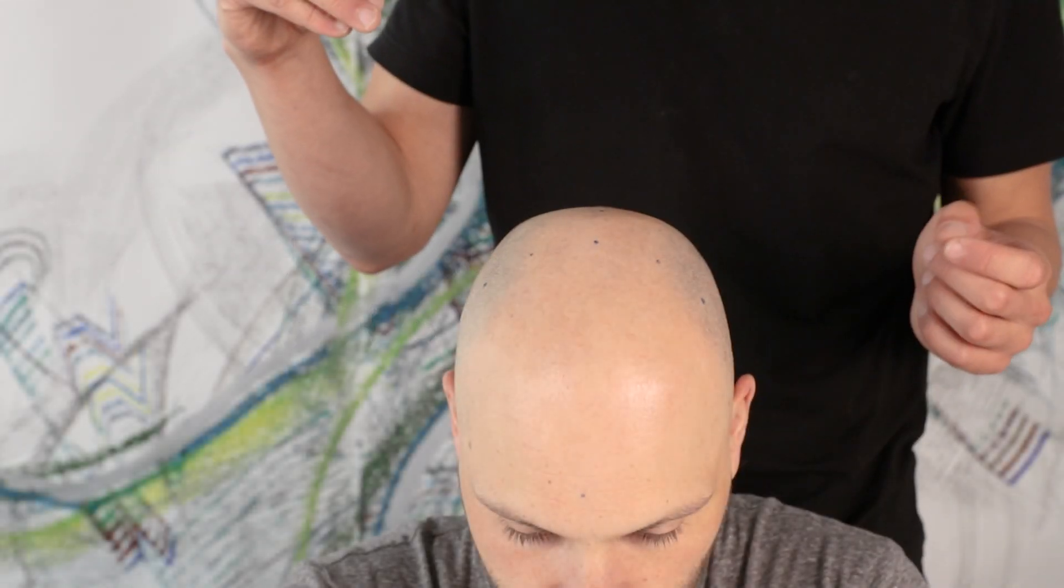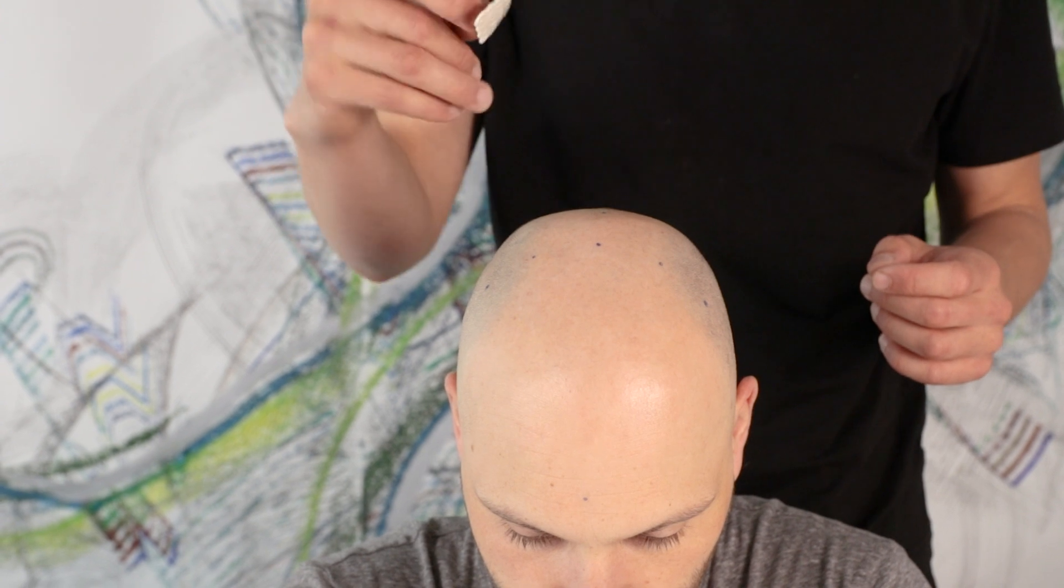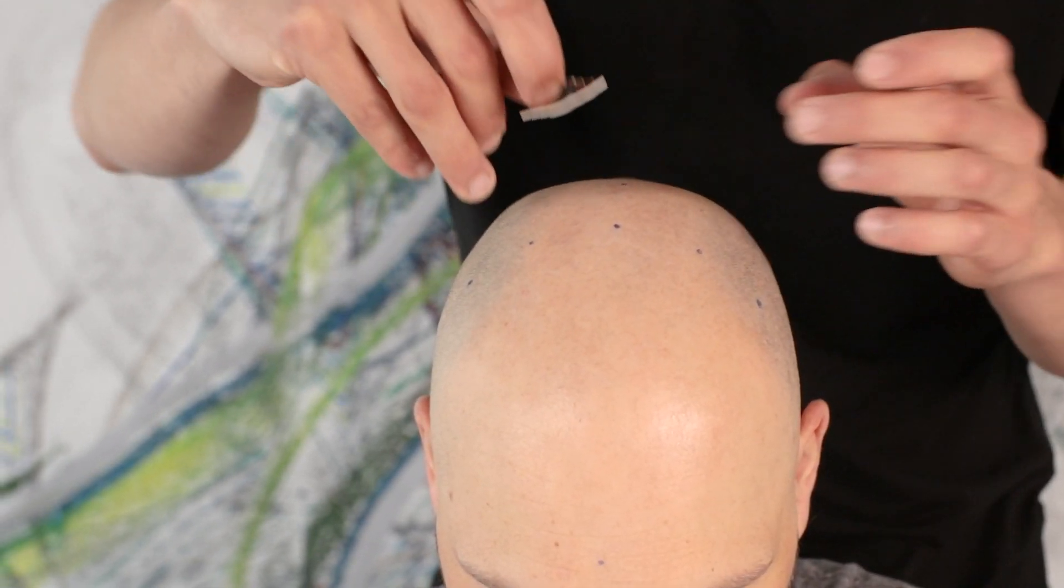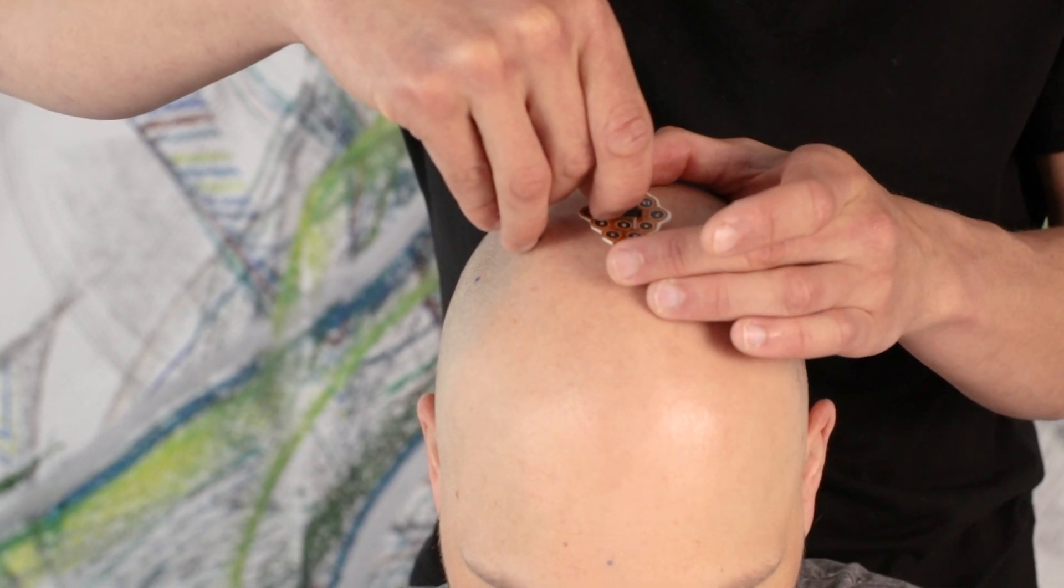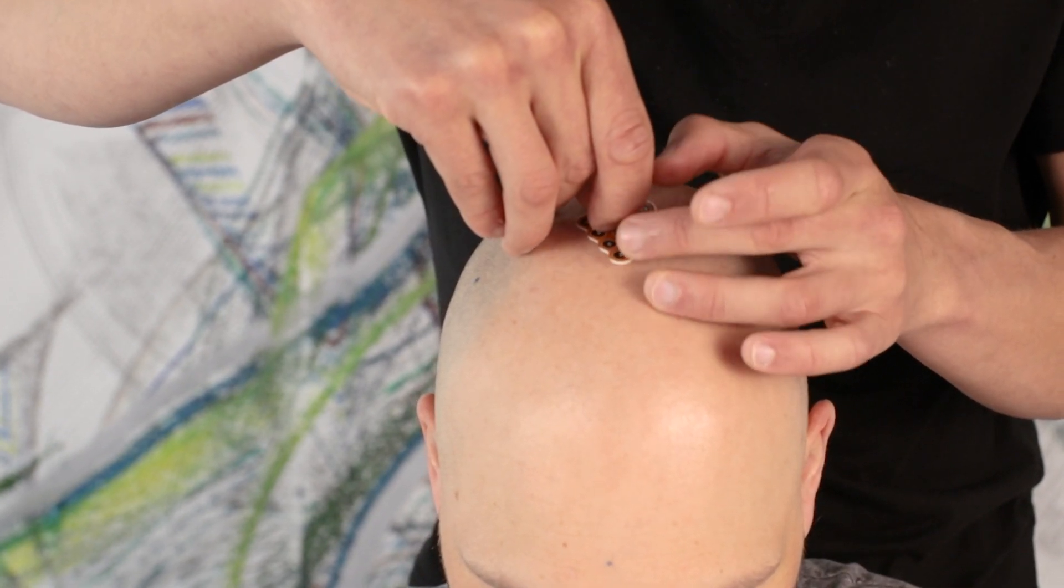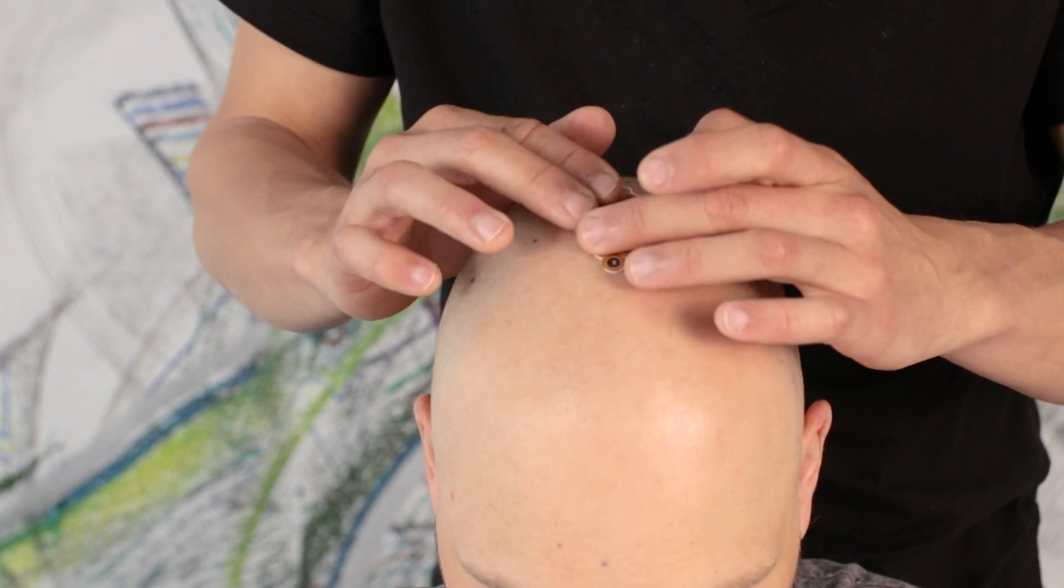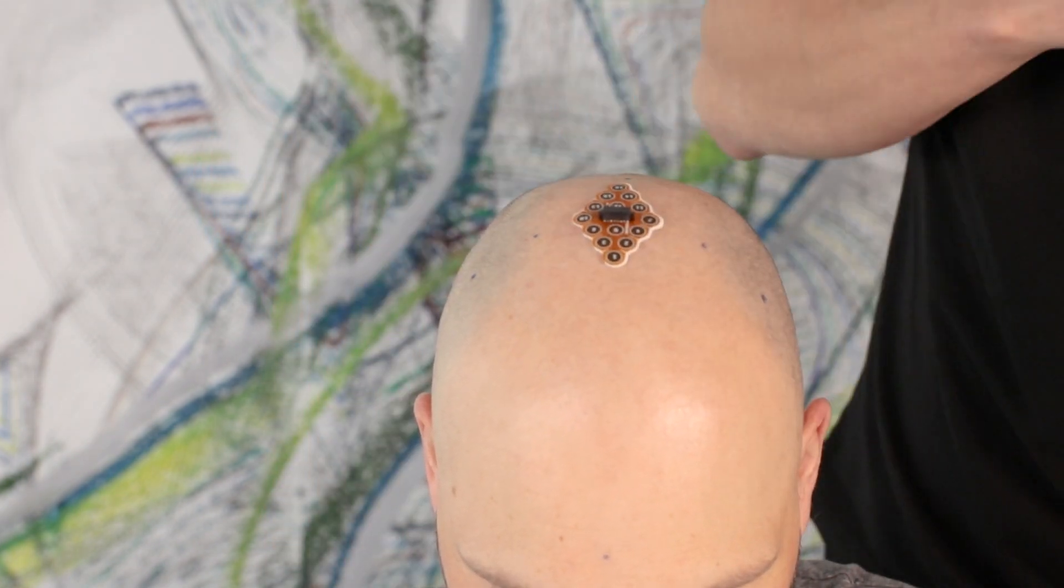As a next step find the marked standard positions and place the grid with the liner removed from the adhesive. Align the grid as you wish and place it on the clean skin.